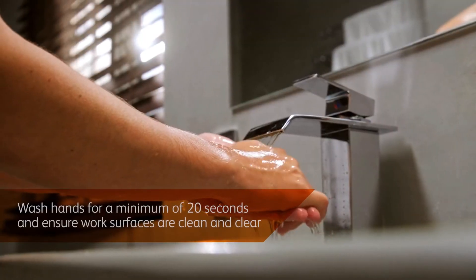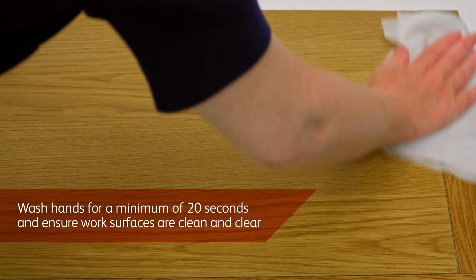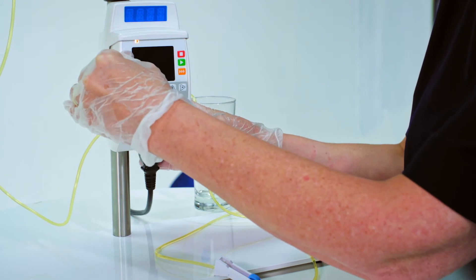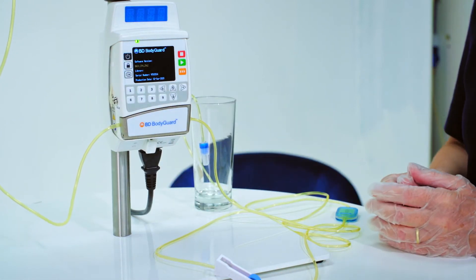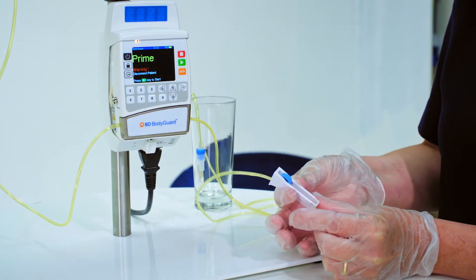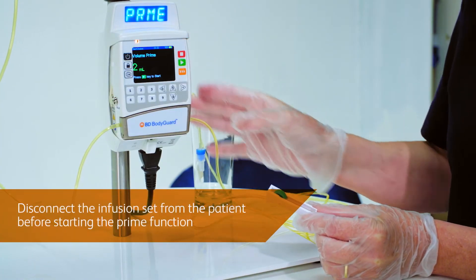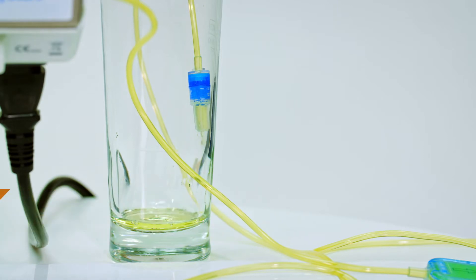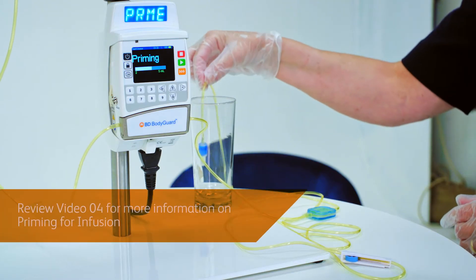Your medical provider will train you on the specific program that your home infusion requires. It is important that you only use the program prescribed for your specific treatment. Before connecting the line ready for infusion, the IV set first needs to be primed. The prime function must not be performed while the infusion set is connected to a patient.